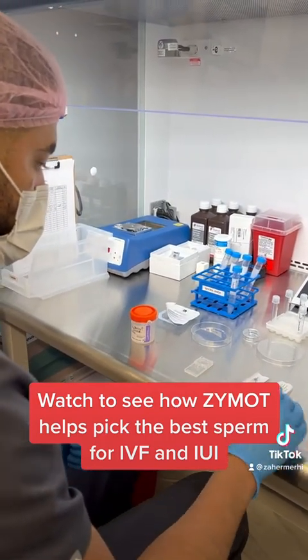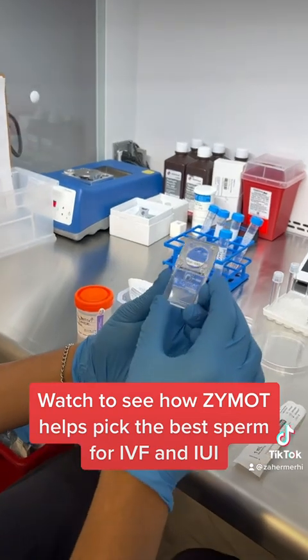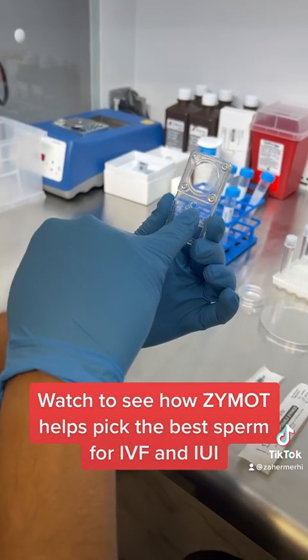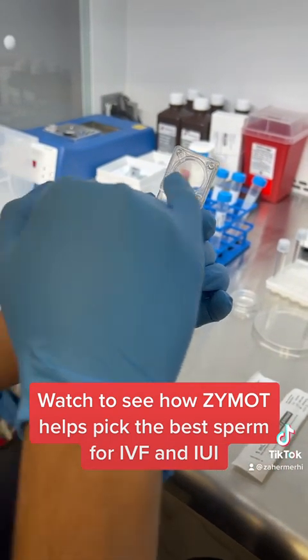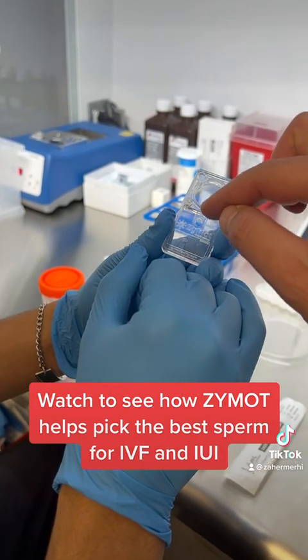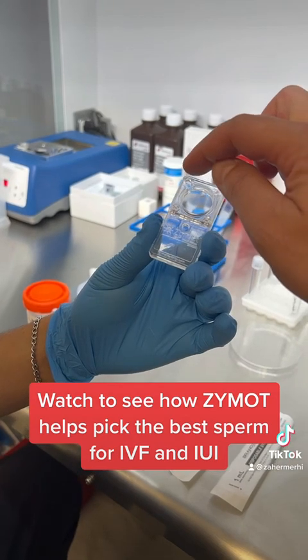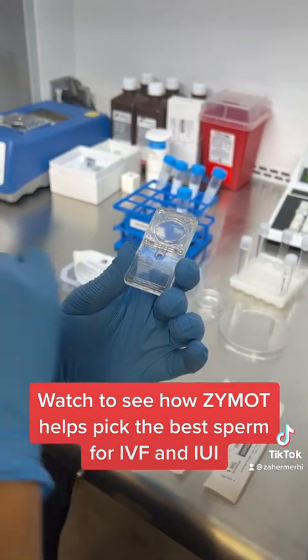So this is an actual Zymot right here. Through this little hole, this is where we would put the patient sample. There's a membrane in here — you can't really see it, but it's there. You put the sperm here and it goes under the membrane, then you pick the sperm from the other side to use after the whole process.